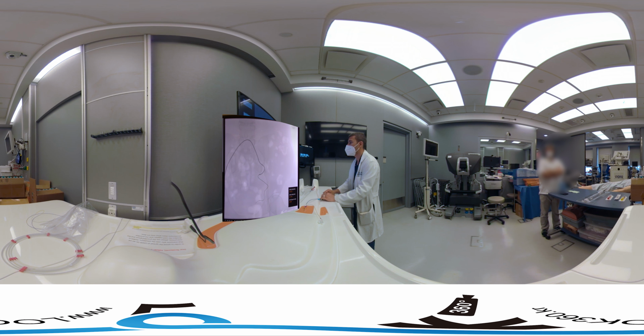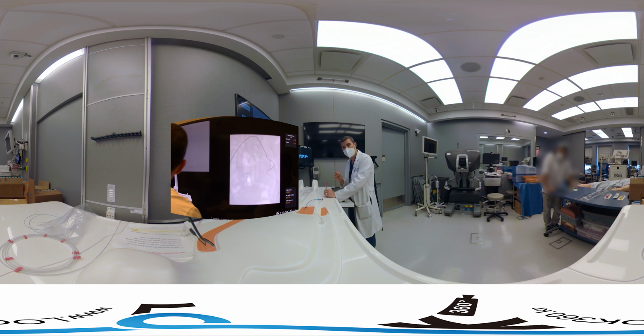Again, we're going to deliver it through the microcatheter, and I've already selected the Embospheres, which are particles in the size range of 500 to 700. So I go ahead, I'm going to do this under fluoroscopy, and you're going to see me injecting right there, and you can see it all going towards the fibroid uterus. We're going to continue to embolize.